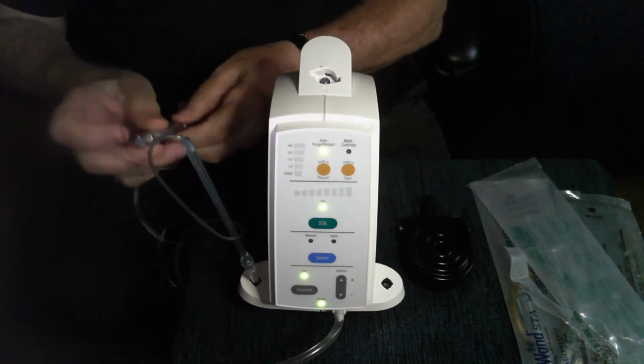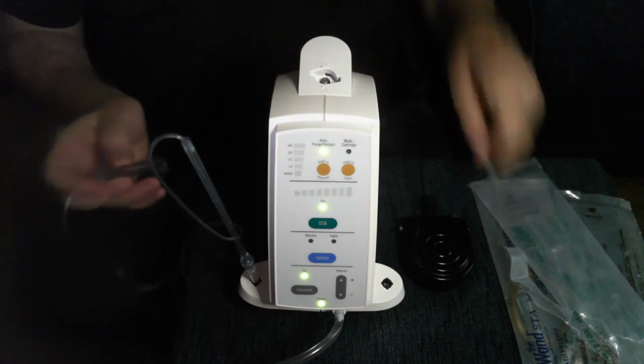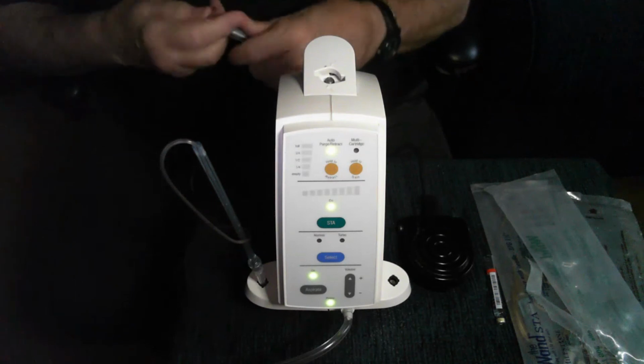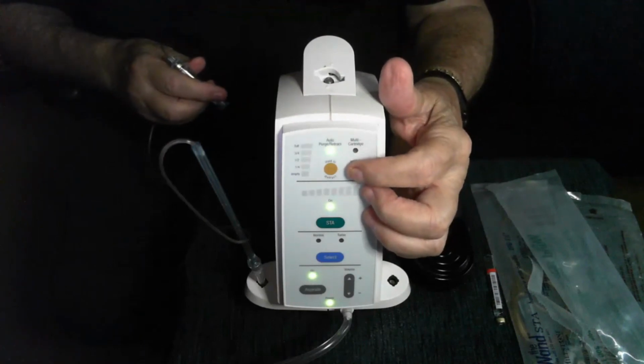This is typically done by your dental assistant. And you can actually leave the needle in place. You can then put the second cartridge in without taking the needle out of the tissue. You keep it at the injection site. Then you press this button called multi-cartridge.